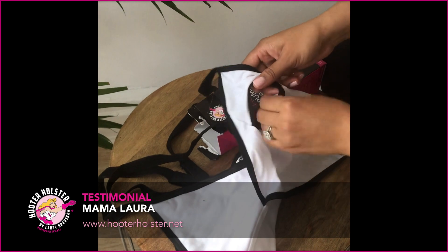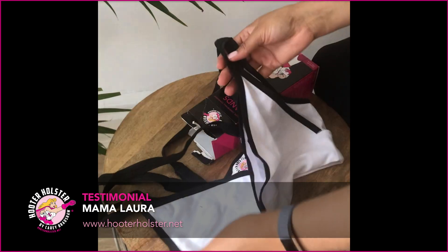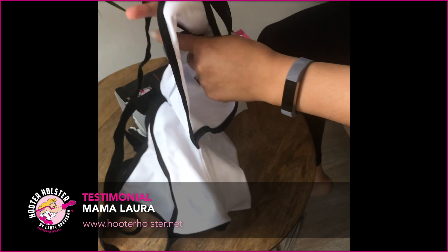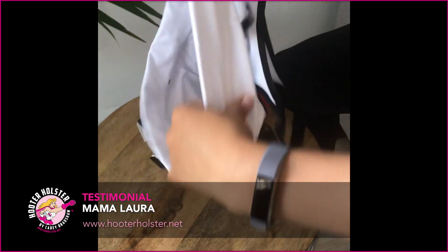You put the pump flanges through here, or if you're nursing and pumping at the same time, you can put one down and then keep the pump on this side. So thanks Carrie for this — this is super cute!